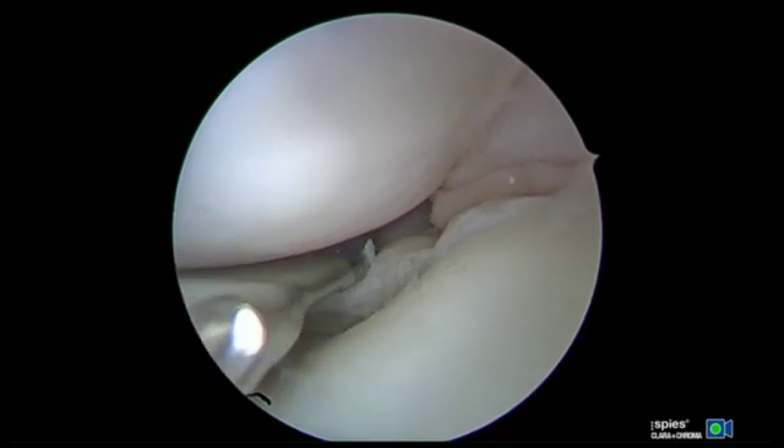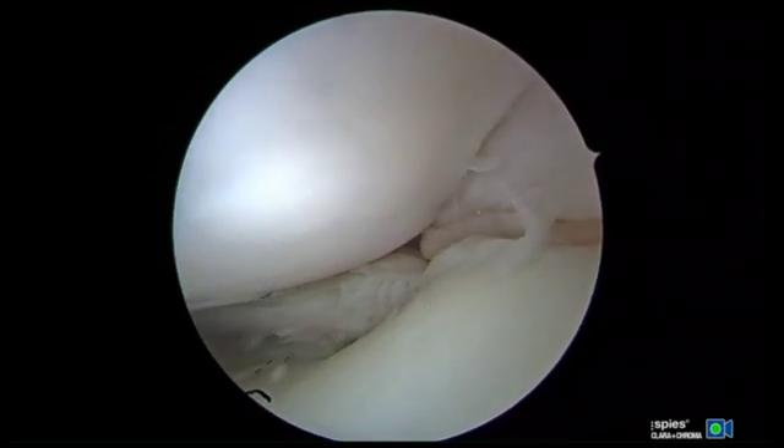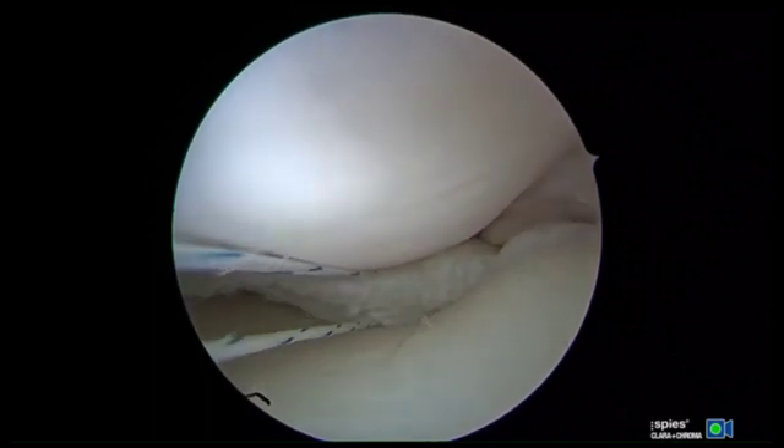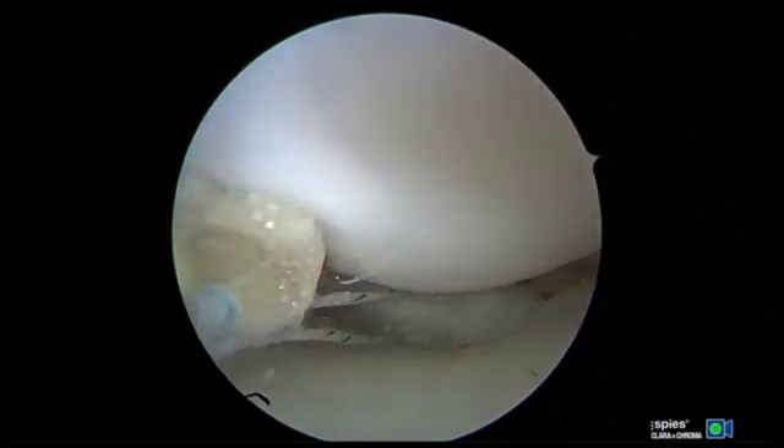The posterior aspect of the tear will be addressed first working through the ipsilateral portal. The Smith & Nephew Novisage Pro all-inside device is utilized to place a vertical compression stitch through the horizontal cleavage tear. When introducing the device into the knee, the upper jaw should be held in a down position to avoid cartilage injury.